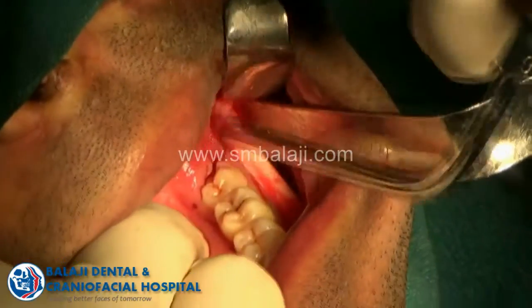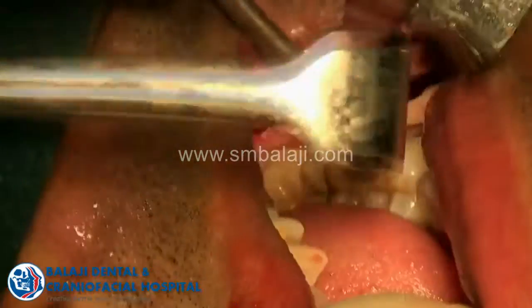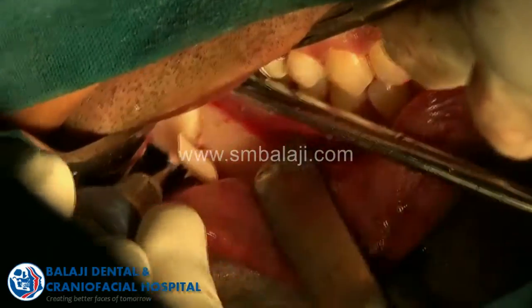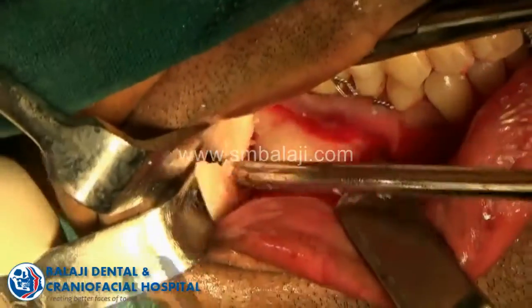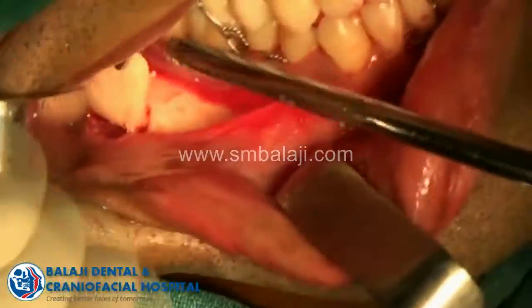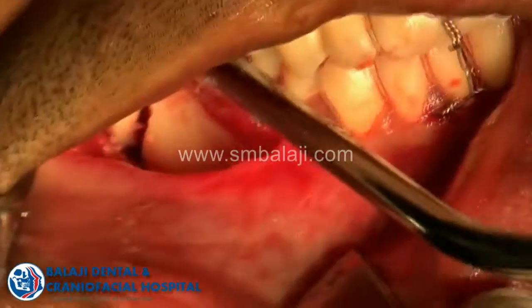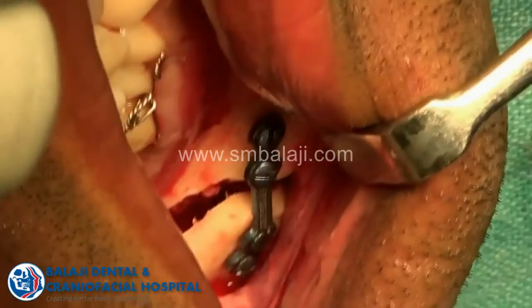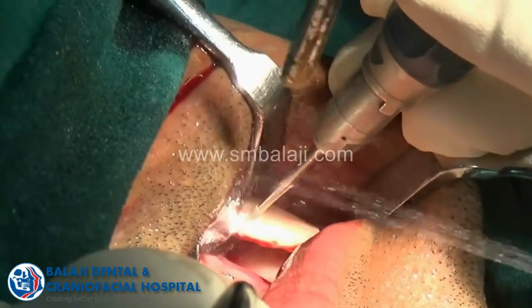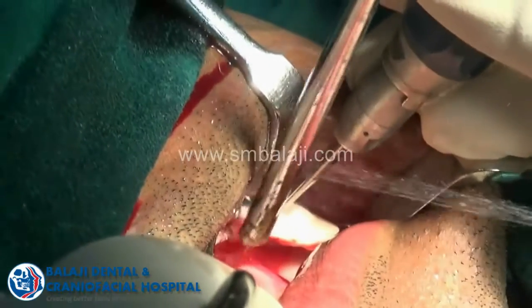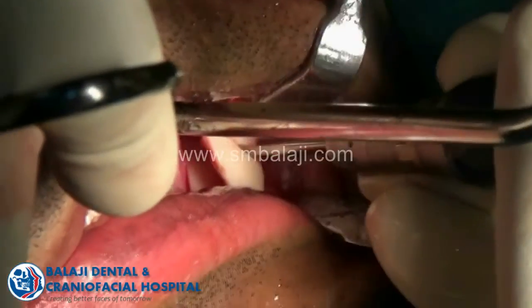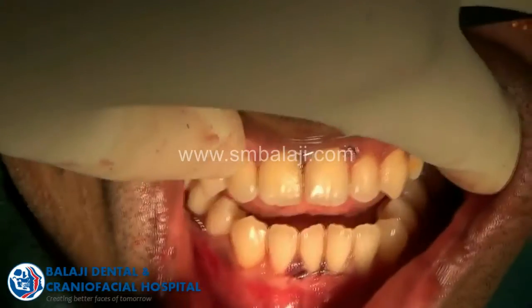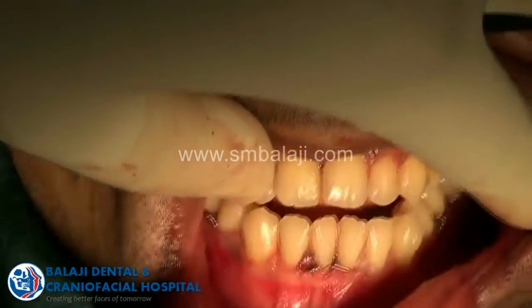I repeat the same procedure on the opposite side. You can see there also a good split. Now remove the excess bone — whatever the measurement says, on either side the bone should be removed. You need to check the condylar position of the mandible, and once you check the condylar position, use a mini titanium plate to fix the mandible. Here also you can see me removing the excess bone.